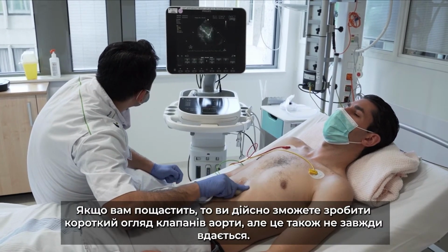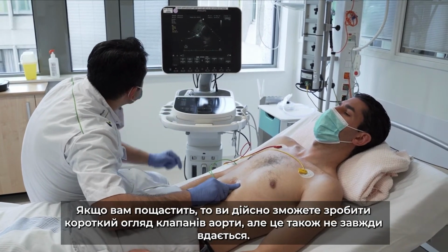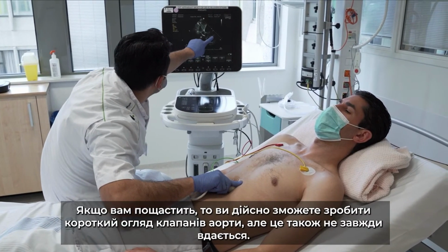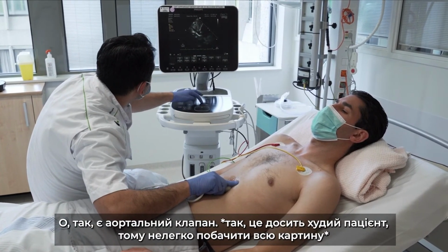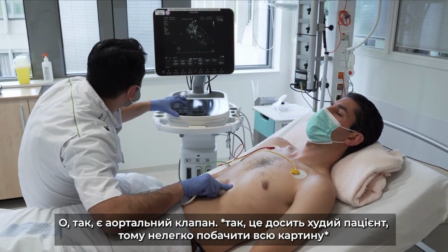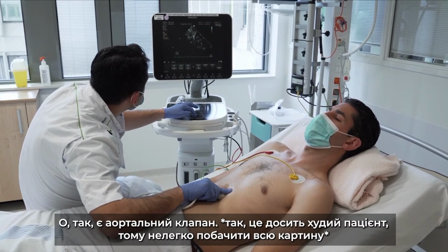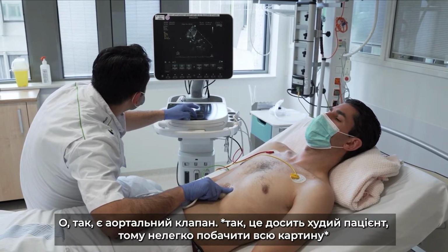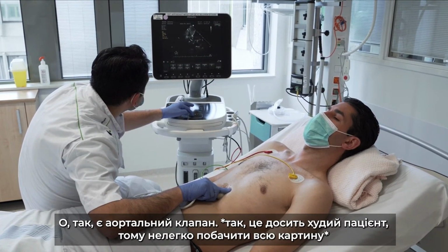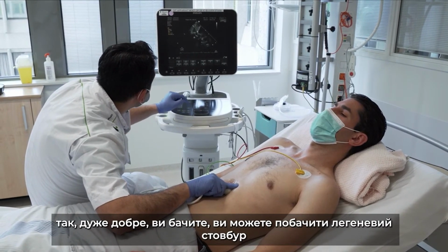But this also works, not always works. And yeah, in the middle is. Oh yeah, there's the aorta valve. Yeah, it's a very slim patient, so it's not easy to have it all in one point. The aortic valve and the pulmonary artery, and the truncus pulmonalis. Yes, very nice. You can see the truncus pulmonalis there.